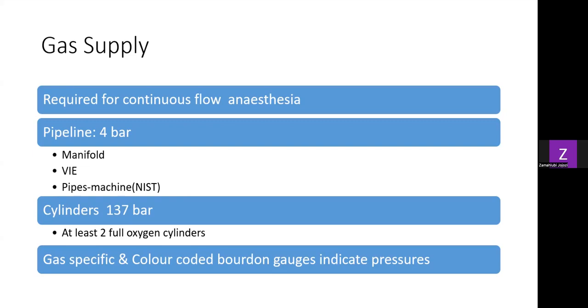So I know that it's stored in liquid form. I just don't entirely remember the whole flow process, because I think at some point it's then converted to gas, but it's stored in liquid form in the VIE. So it's cooled down to liquid.